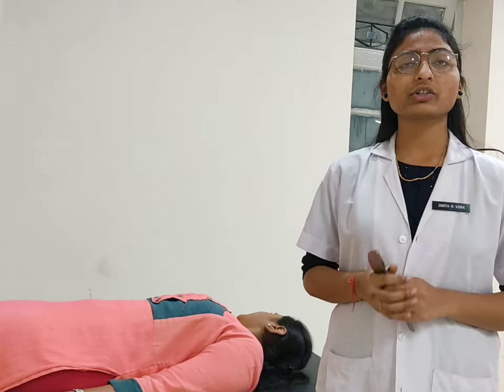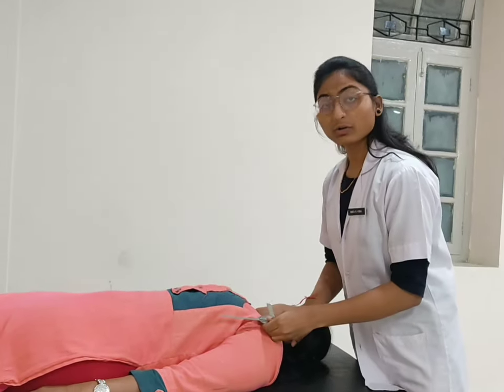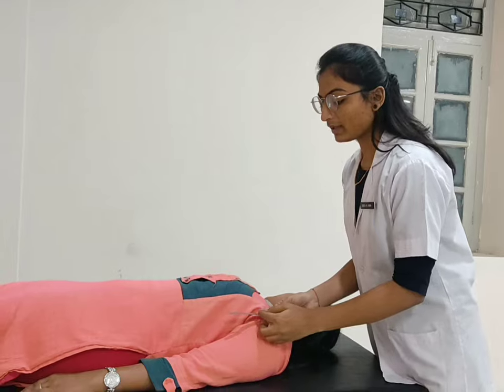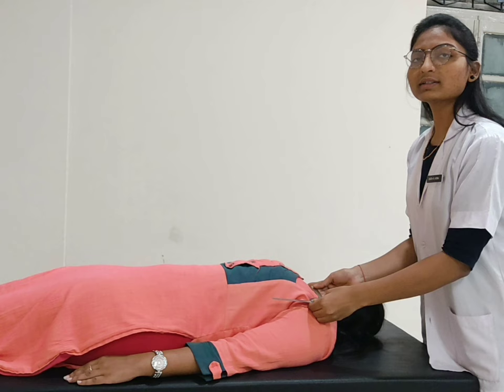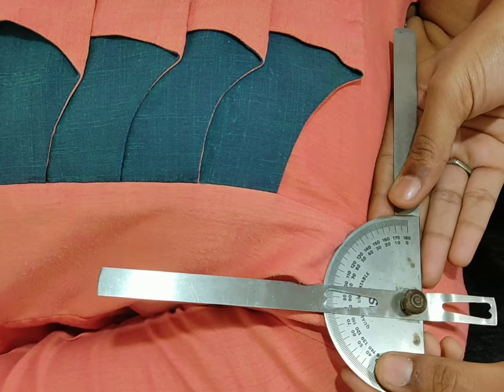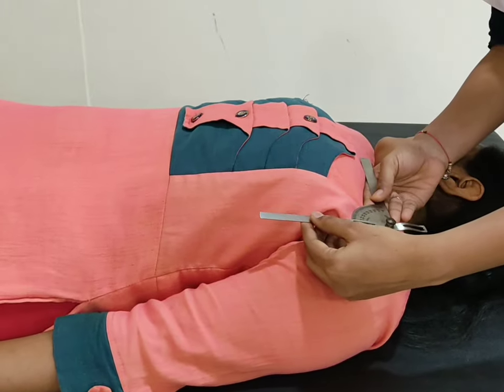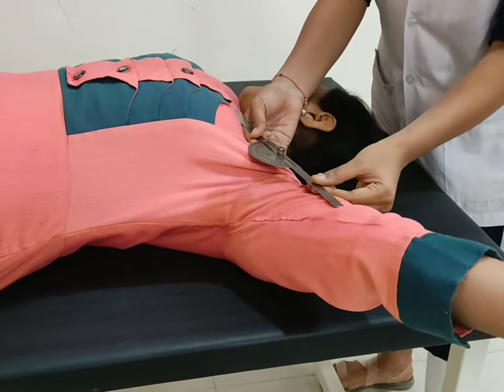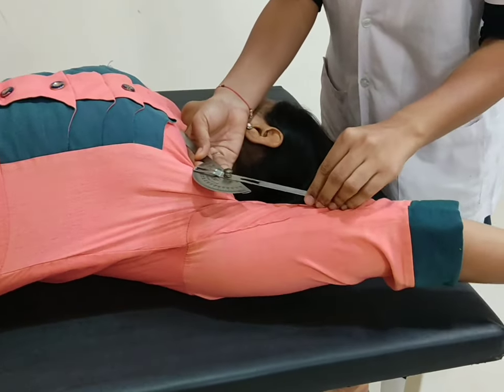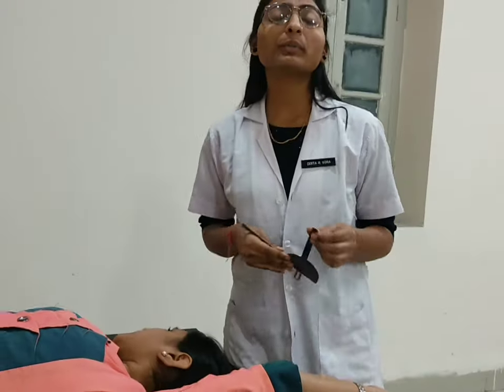For shoulder abduction, patient position with fulcrum placed over the acromion process. Moveable arm parallel to the anterior aspect of the arm and stable arm placed horizontally. Now ask the patient to move your arm away from the body. Normal range of motion for shoulder abduction is 180 degrees.